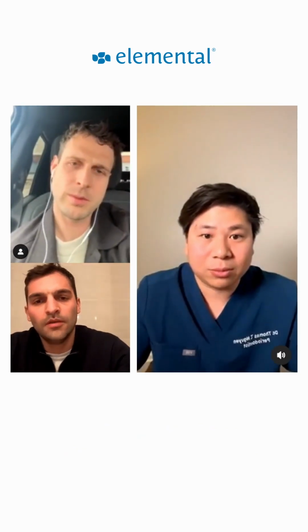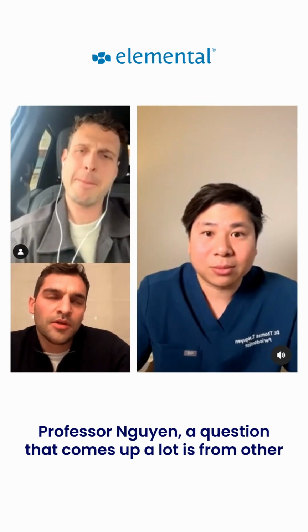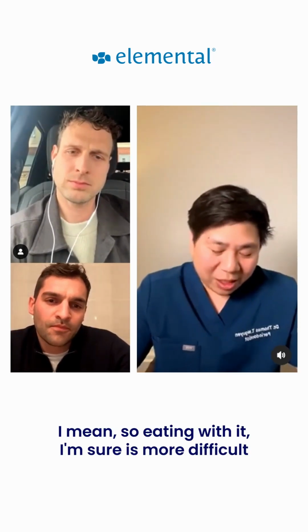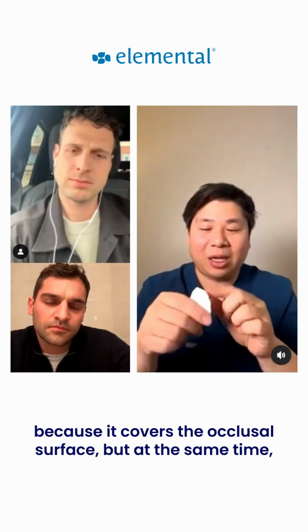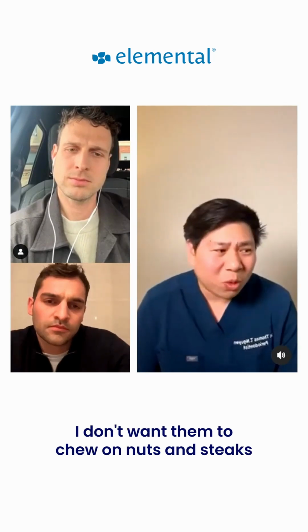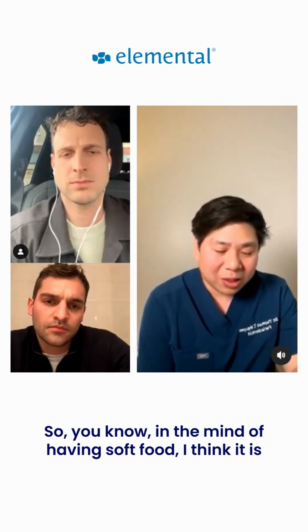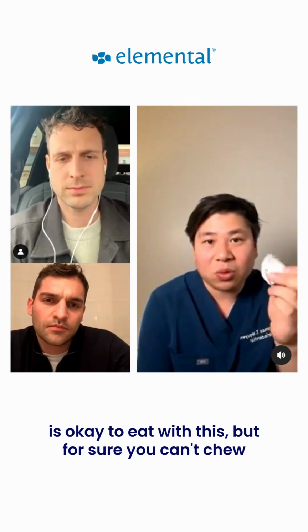Yeah, cool. Professor Nguyen, a question that comes up a lot from other clinicians is whether patients do wear it while eating or not. Could you elaborate a bit on that? I mean, eating with it, I'm sure, is more difficult because it covers the occlusal surface. But at the same time, I don't want them to chew on nuts and steaks and all things like this. After the surgery, they should eat softer food. So, with the mindset of having soft food, I think it is okay to eat with this.